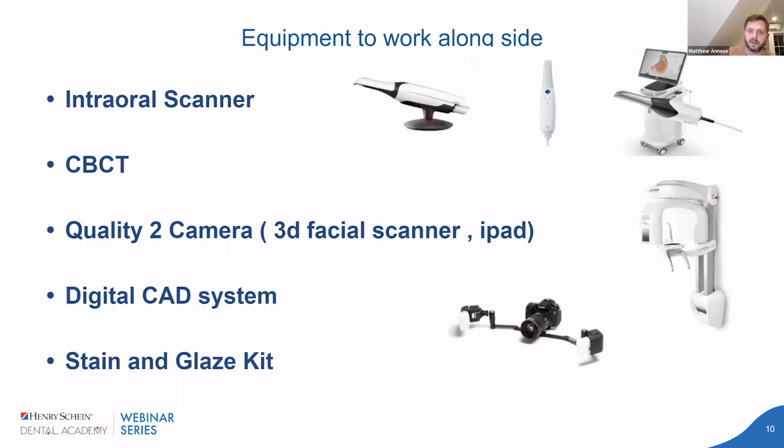I believe in it. The prices have come down so much. What you can do with these scanners is amazing. So I would say get into digital scanning before you get into 3D printing, but definitely do both. Sometimes, like I said, I bought my 3D printer bundled with the Trios.